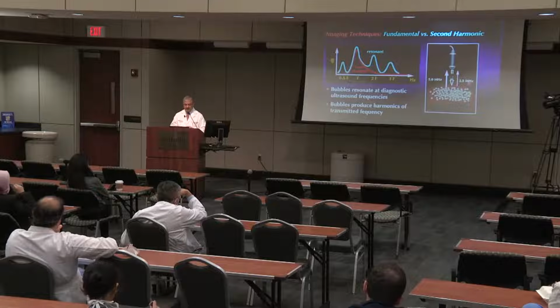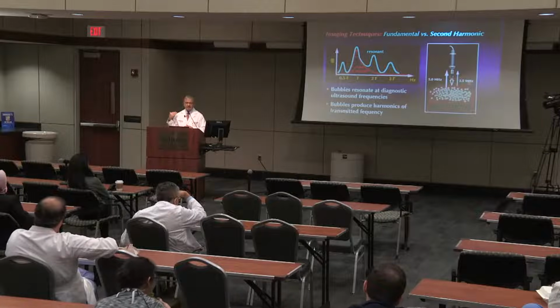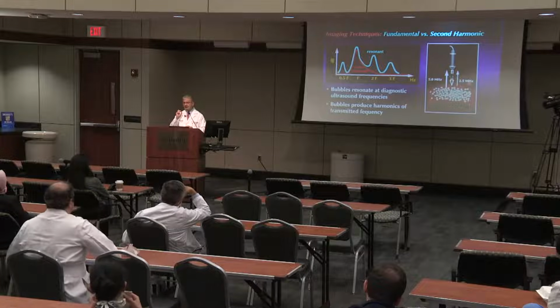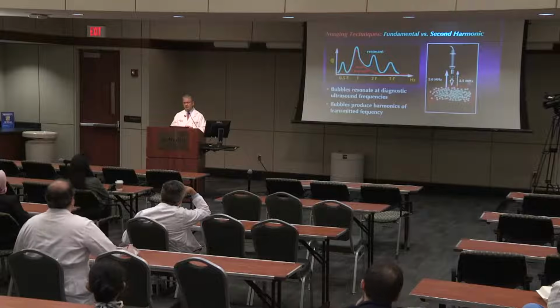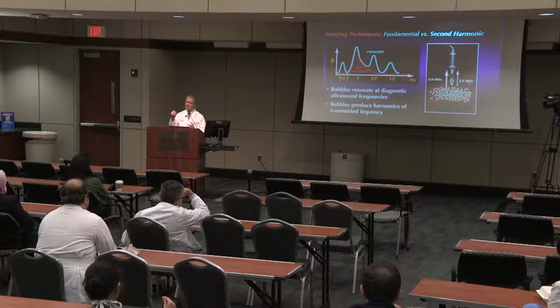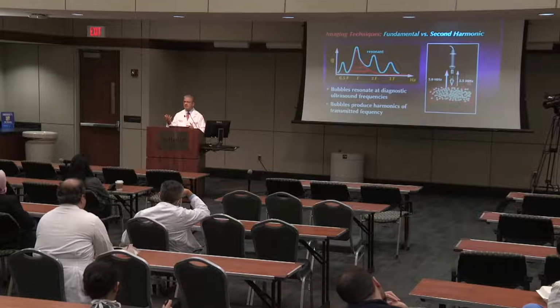Now, the neat thing is, you heard about harmonics. Traditionally, I mean more than 25 or 30 years ago, imaging used to send a certain frequency called the fundamental frequency, and whatever is reflected back will be at the same frequency.